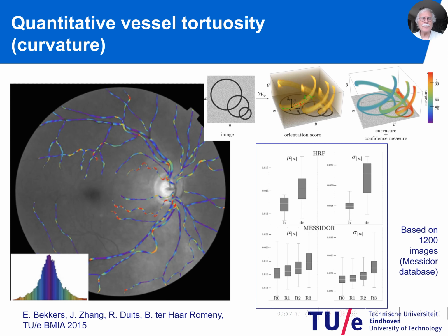So here we see to the left the measurements that we did. Every point on a vessel has a certain curvature. So we have lots and lots of curvature points. And you see the color indicates the curvature. Red means a very high curvature. And you see the histogram below, we have positive and negative. And in the middle is blue, there are straight areas. We did it again with our rotating filter technique.